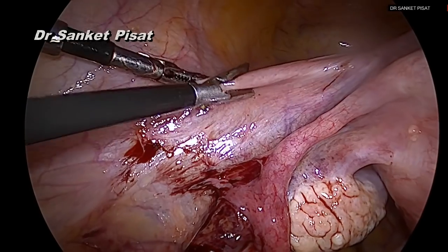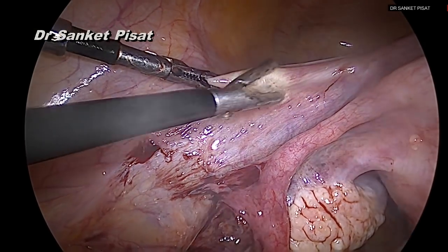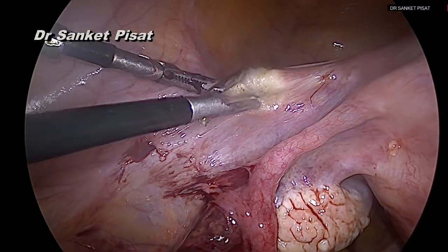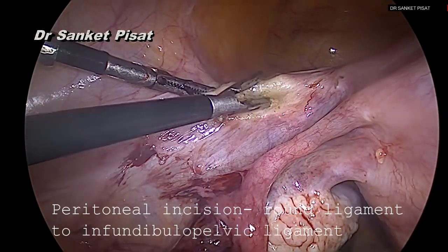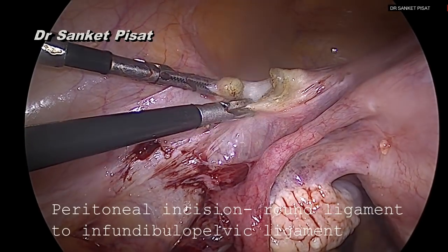We then find the ureter and then the uterine artery before ligating it. The dissection starts with gaining entry to the retroperitoneum. Although there are several ways to do this, one of the easiest ways to gain access to the retroperitoneum is by cutting the round ligament.